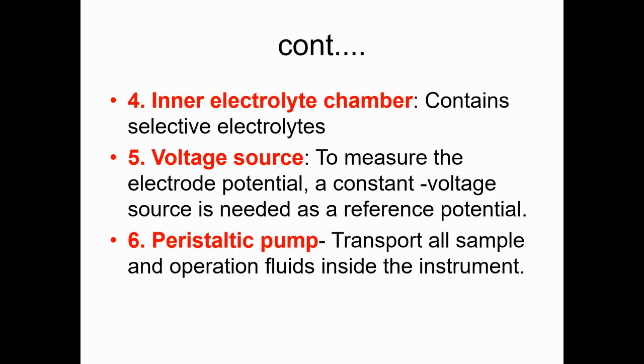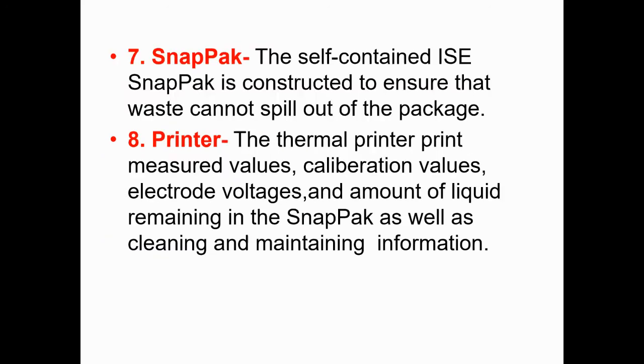What is a peristaltic pump? As we all know, peristalsis movement is nothing but transport. So transport of all samples will happen by this one. Transport of all samples and operation fluids inside this instrument only. That's why it is given the name peristaltic pump.